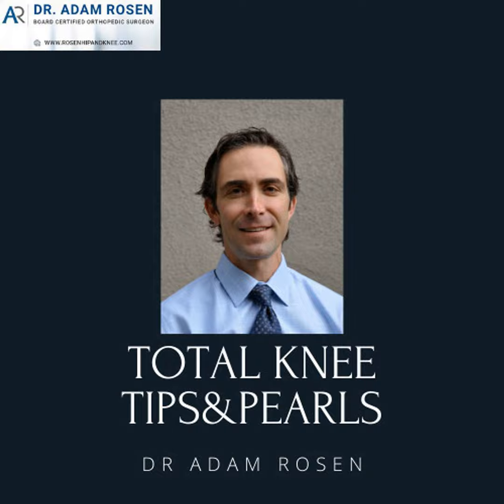The next thing I do is extension and external rotation. And I see the big mistake here is people will extend the leg to check extension, but then let the hip come forward and flex and externally rotate it. And that doesn't truly check. What I'm looking for is an extension.